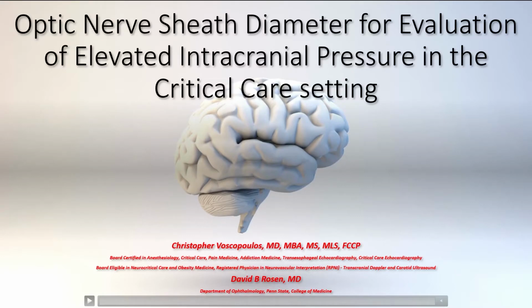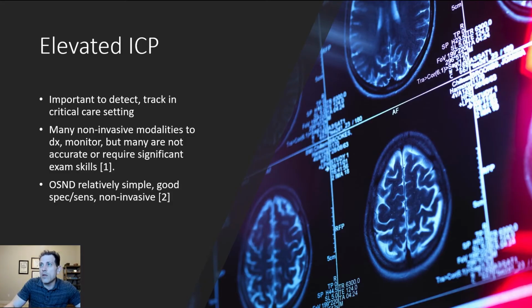But maybe also from a different perspective, say if you are a clinician that has responsibilities in helping to manage off-site services, say via telemedicine, at say maybe some critical access facilities. This is a way for us to teach our emergency room physicians a technique that they could give us very valuable information for us to assess whether or not we need to institute immediate treatment in this patient population. So with that being said, let's dive into it a little more deeply.